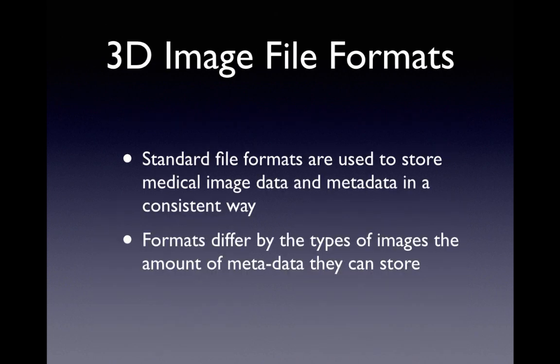Three-dimensional images are stored in a variety of different file formats. Just like for two-dimensional images, we have PNG, and we have TIFF, and we have JPEG. For three-dimensional images, there's a variety of formats. And different formats store data and metadata in different ways. So there are some formats that we consider recommended because they capture all of the metadata in a consistent and robust way. And some formats that are a little older, perhaps, like the Analyze format, that might not capture all of the information and then give us more problems when we work with them.